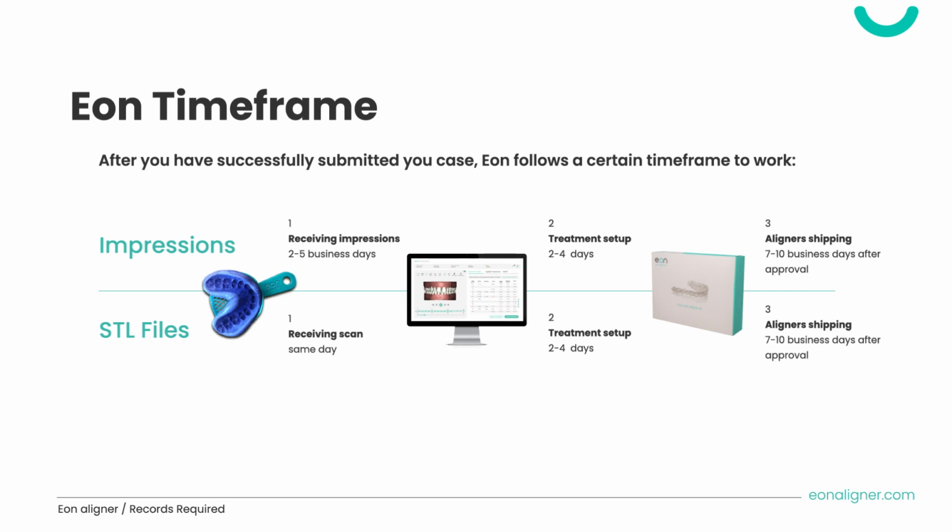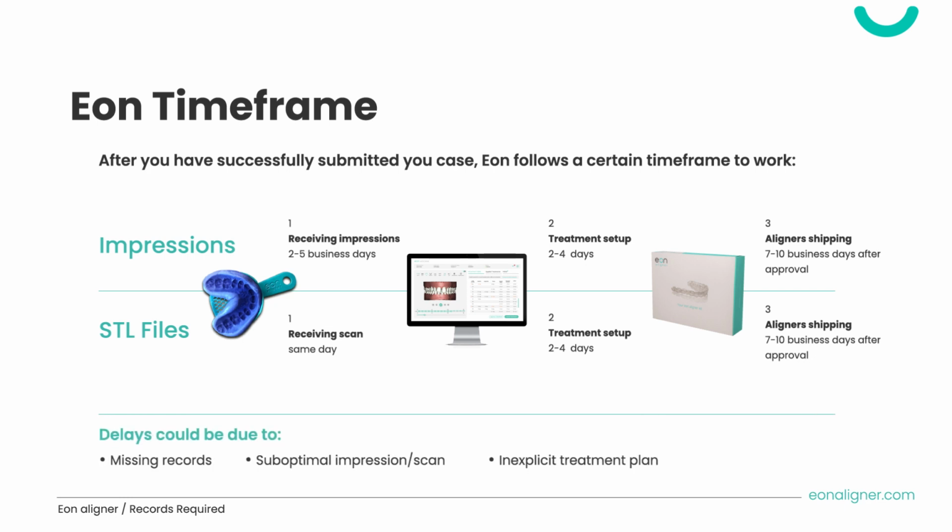The only difference in the time frame, if you are using an intraoral scanner rather than the impressions, is that the treatment planning team will start generating the TS faster as soon as the STL is received. Delays in the time frame could be a result of the following reasons: missing records, suboptimal impressions or scans, or an inexplicit treatment plan.